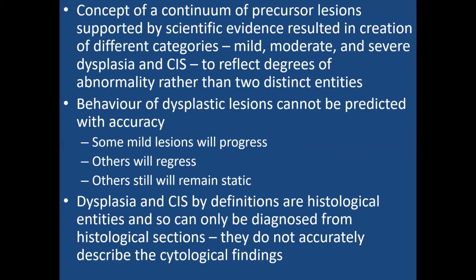So the dysplasia has three categories depending on the severity of the dysplastic change. So we have mild, moderate, and severe. And then the severest form of them is the carcinoma in situ. There's an image coming up that I'll show you.